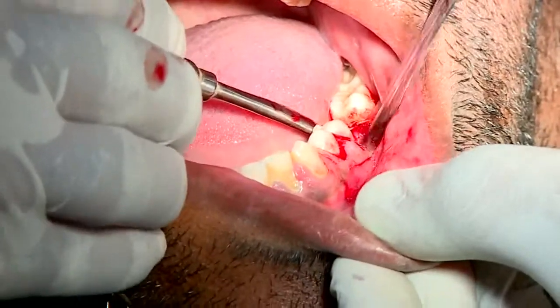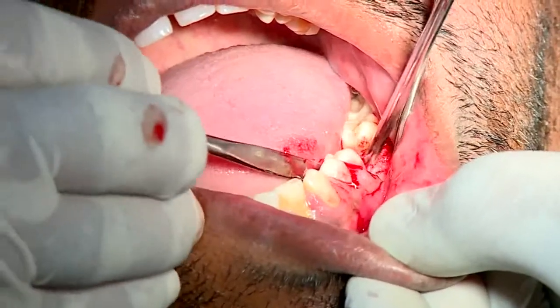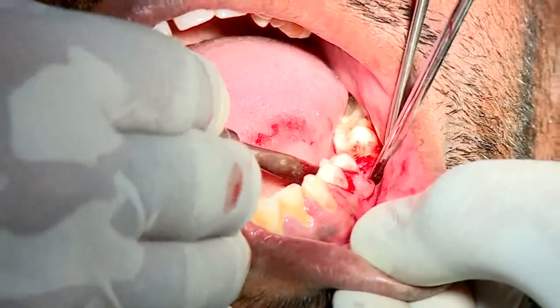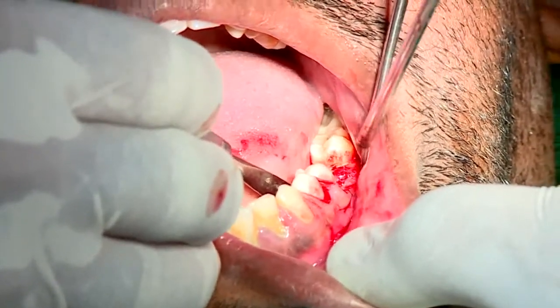So now, not sure whether the camera is focusing. Now we have raised the buccal flap, and now I have raised the lingual flap as well. Can we have a little bit of saline in there, please?